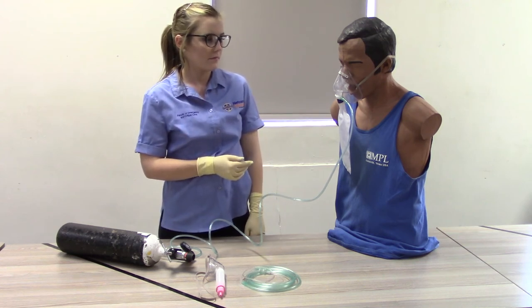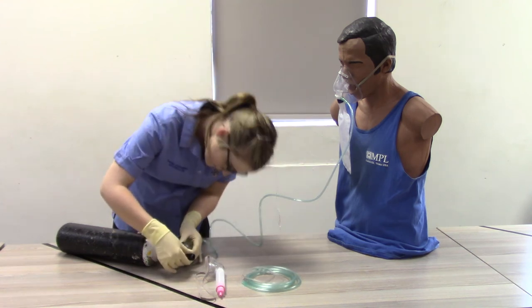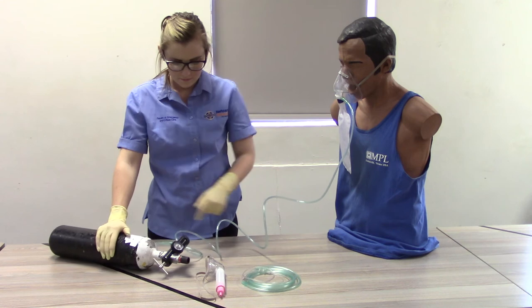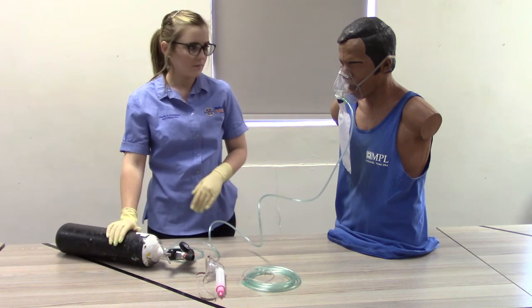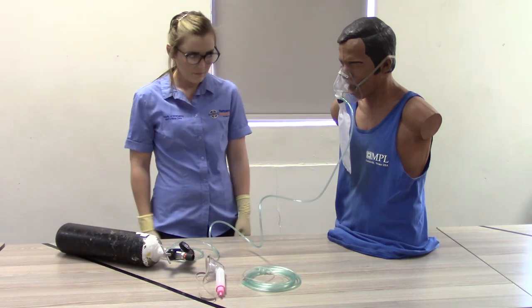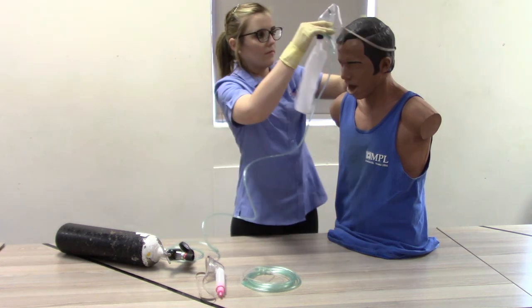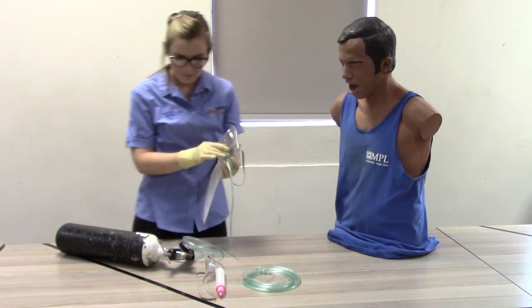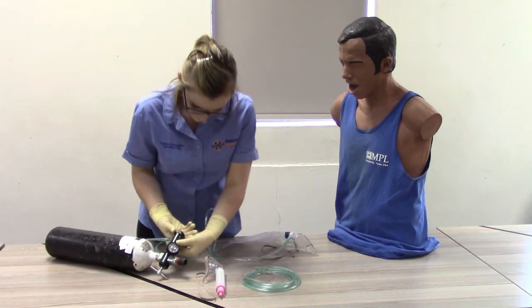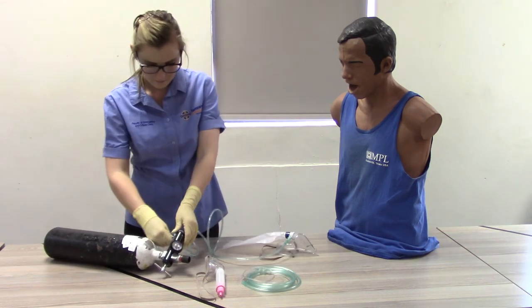Monitor the patient's response to oxygen and the oxygen delivery device. Periodically check the regulator gauge to ensure that sufficient oxygen is still in the cylinder. Step 5: Removal of oxygen delivery device. Remove the oxygen delivery device from the patient and close the flow regulator. Disconnect the oxygen tubing from the pressure reducing gauge.